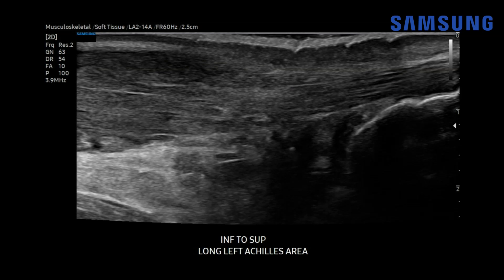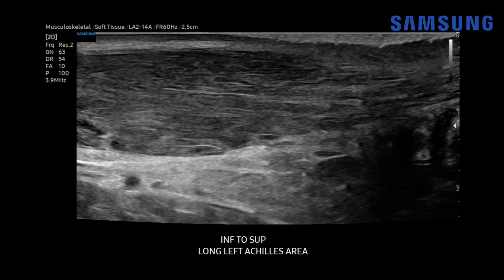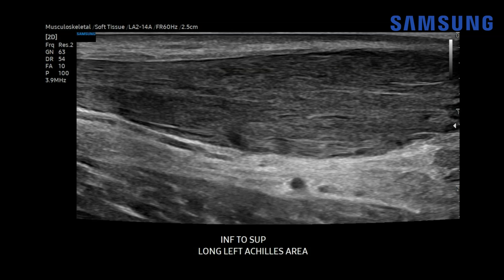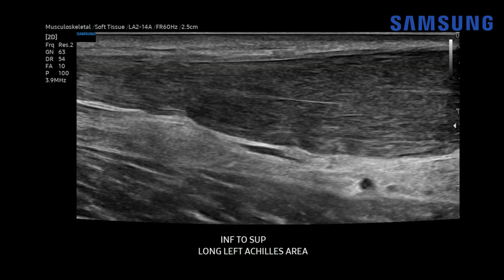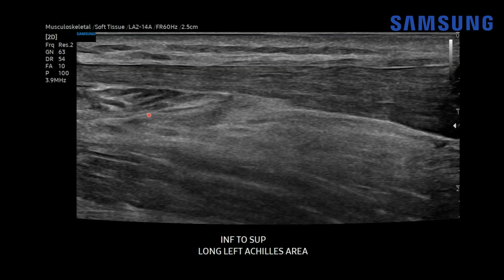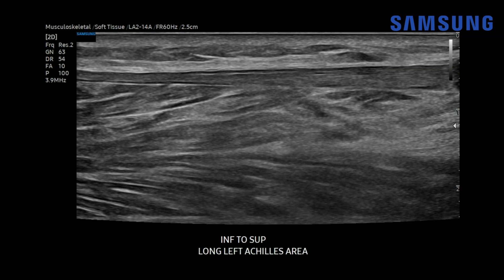But notice as we move superiorly, the Achilles tendon starts to expand and has more of a fusiform heterogeneous configuration. We have areas of hypoechogenicity at the deep or anterior aspect of the tendon. As we move more superiorly, the tendon starts to assume a more normal caliber and configuration. Now we're getting into the soleus muscle here, and then the tendon looks even more normal at the superior aspect.